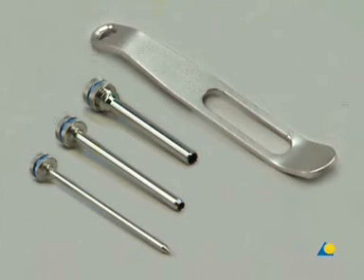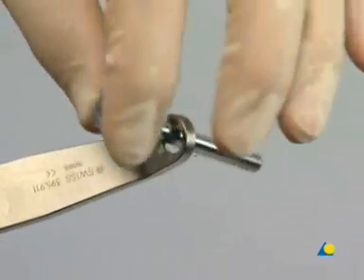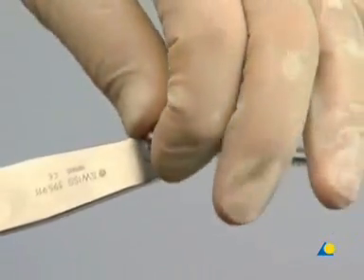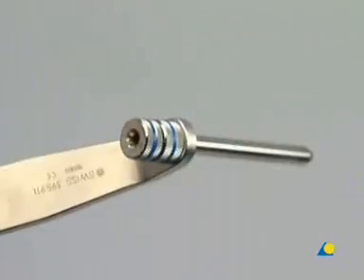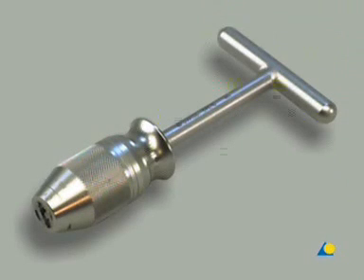Also needed is the drill sleeve assembly, which includes the handle for drill sleeves, the short 6.0-5.0 threaded drill sleeve, the short 5.0-3.5 drill sleeve, and the short 3.5 trocar. The universal chuck with T-handle may also be used to advance the Schanz screws.